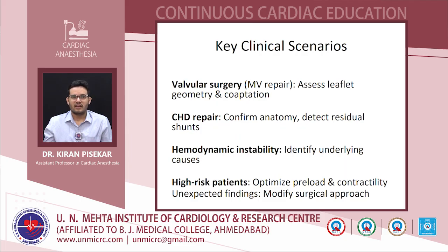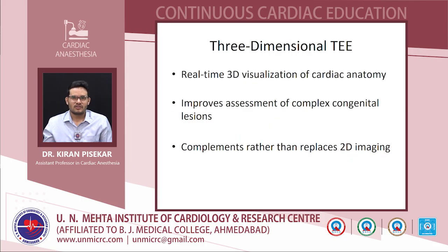So as I showed you the left SVC, the TEE image showing the left SVC. Intraoperatively, when we detect the left SVC, it changes the cannulation strategy. So it modifies, or it will change, the surgical plan.